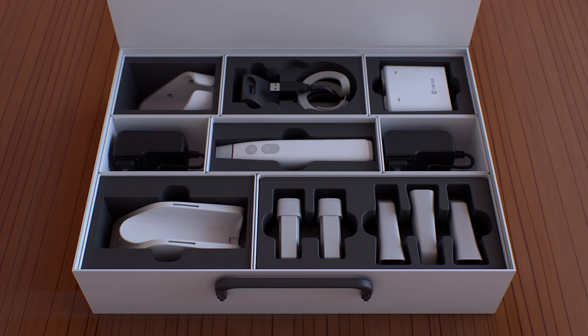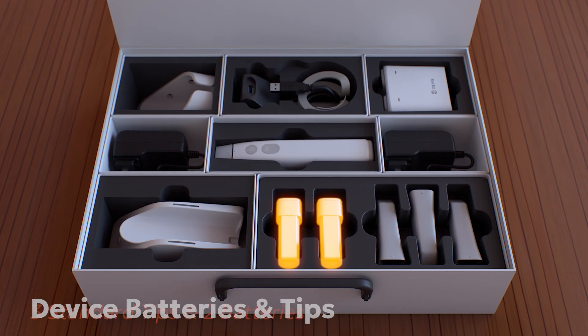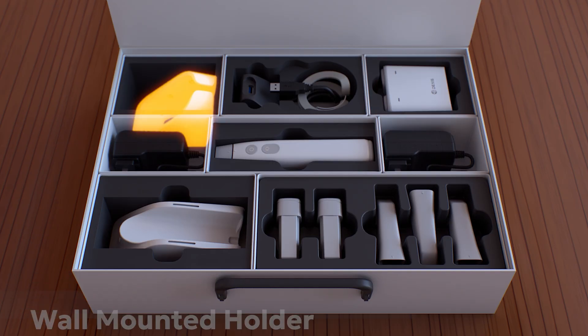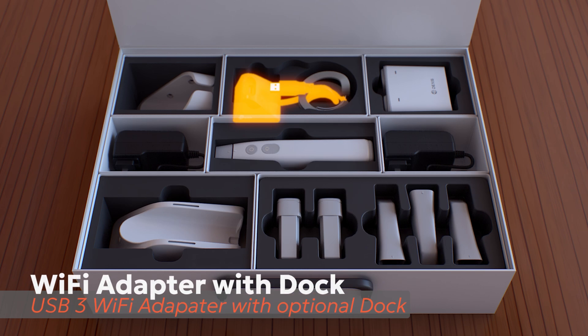Each system includes three standard tips for capturing high-accuracy digital impressions, two rechargeable batteries for full wireless flexibility, a battery charger capable of charging two batteries at once so you're always prepared, a wall-mounted holder for securely installing your charging station, a high-speed Wi-Fi adapter for fast, stable wireless data transfer, and a dock for the Wi-Fi adapter providing added flexibility when space is limited.